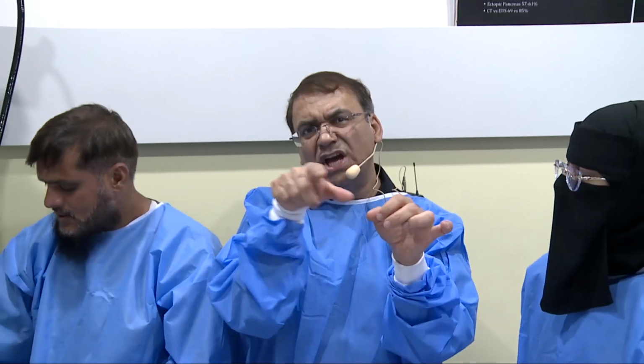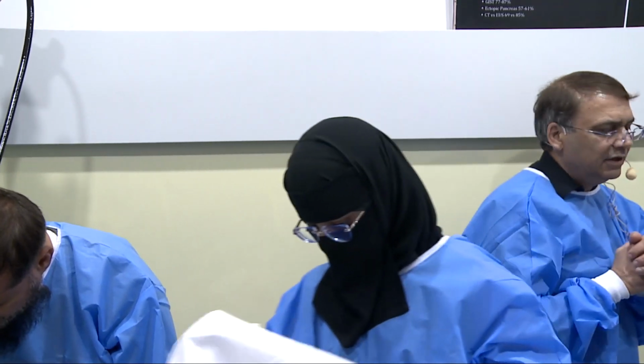You have a nice fluid medium around your probe. The rectal wall is kind of compressed around that. You start pulling back, and what you are looking for is a breakage or a tear in that area, which is going through the wall, and that's the only way. But it's not always possible, especially if it's really small. It may not be a very effective modality, but yes, you can look for that to get an idea where it is. If you have a good MRI facility available, then that's obviously going to give you a much better view.